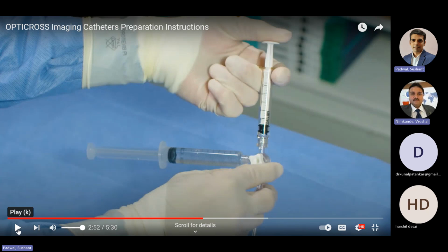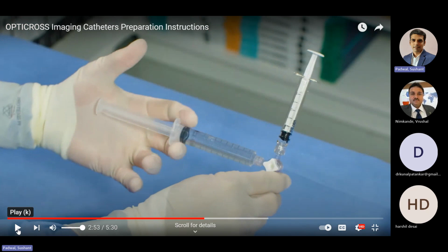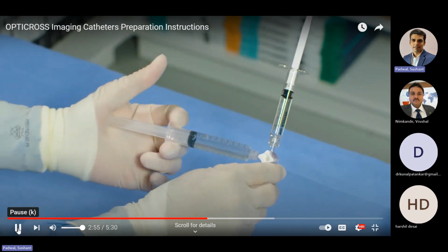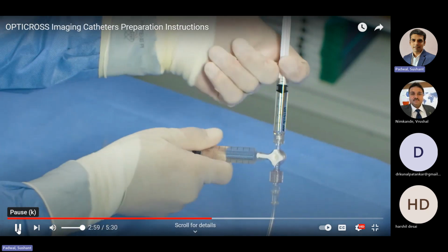Imaging window means the transparent segment of the IVUS catheter towards the tip. Refill the 3 cc syringe using the 10 cc. Slowly flush the catheter a second time.